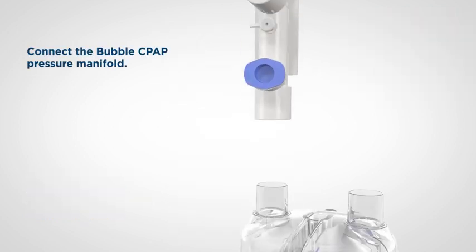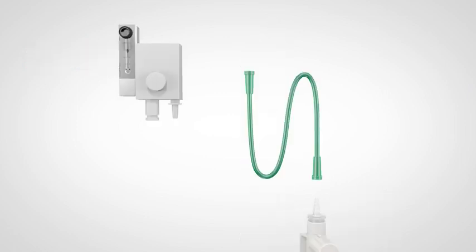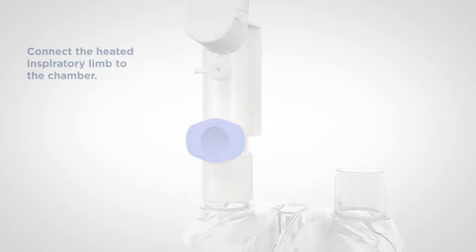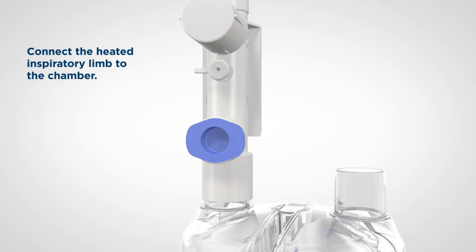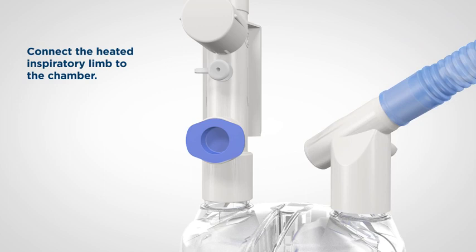Connect the pressure manifold to the chamber inlet port. Connect the green oxygen tubing between the pressure manifold and the flow source. Connect the white elbow-shaped connector of the blue corrugated inspiratory limb to the other port on the humidification chamber.